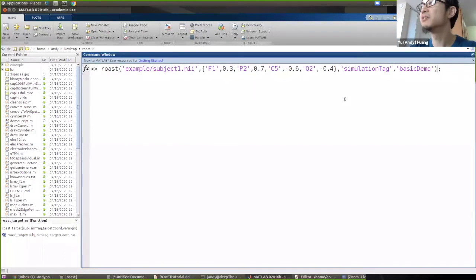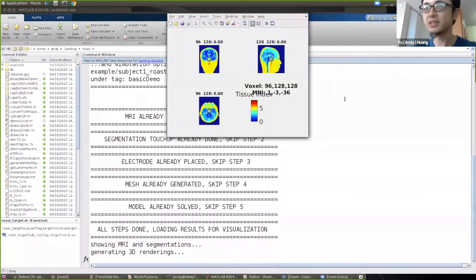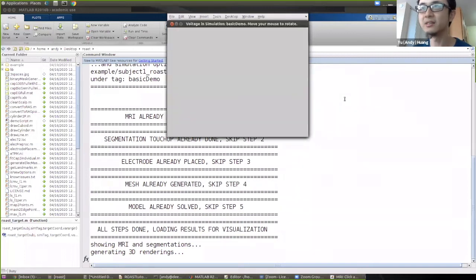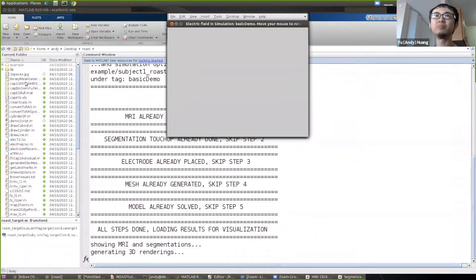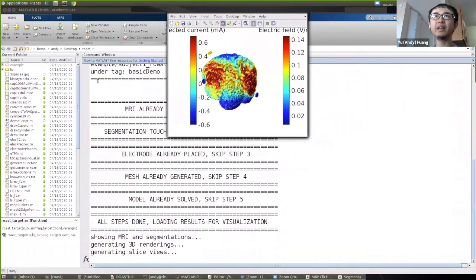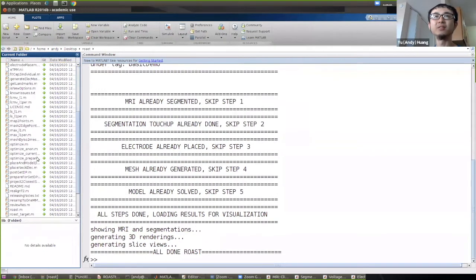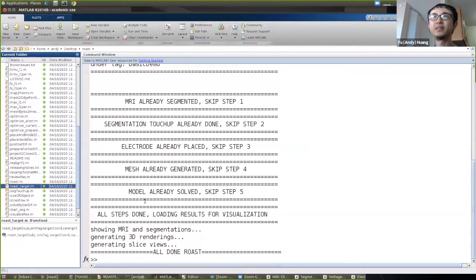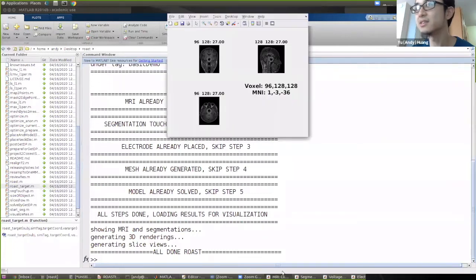Once you're ready, hit enter to run the simulation. Because I already ran this before, it's just loading the results. When you run ROAST, make sure you're in the ROAST root directory where you can see the example folder and all the ROAST functions.